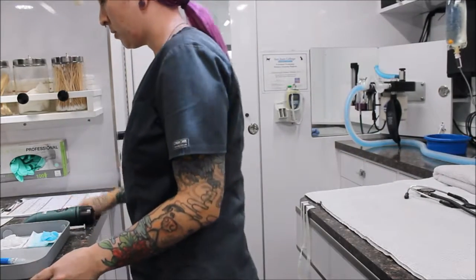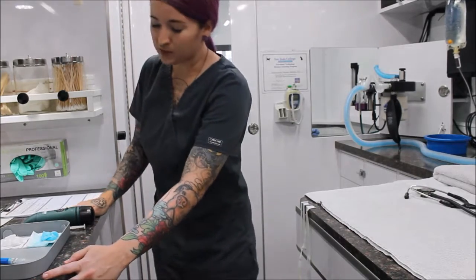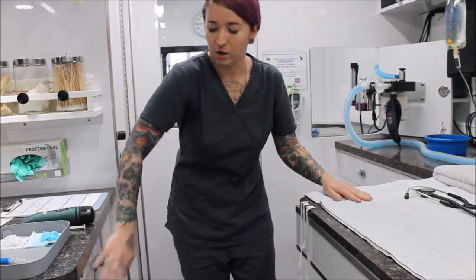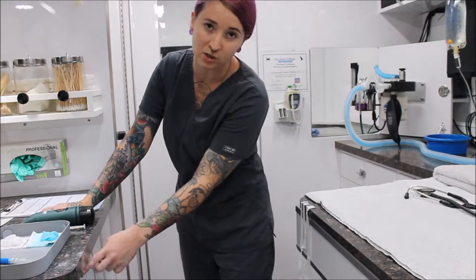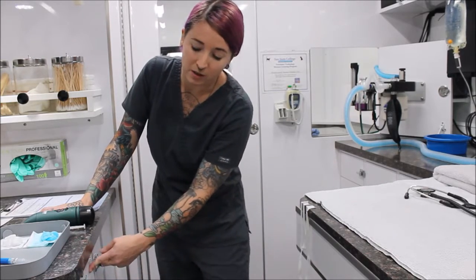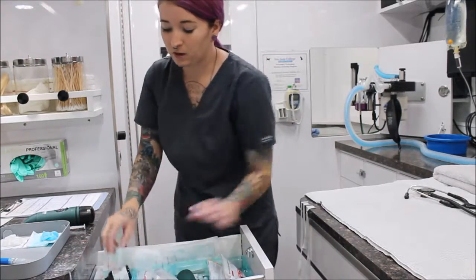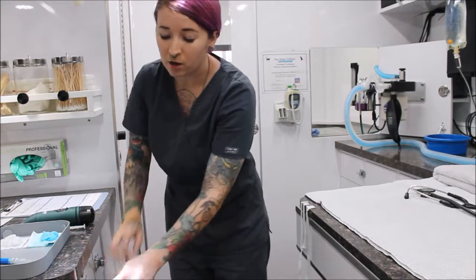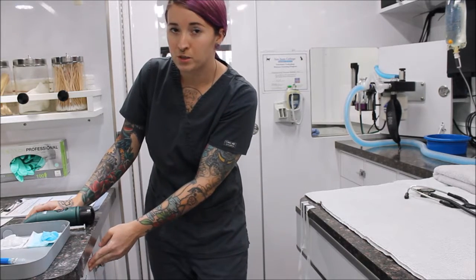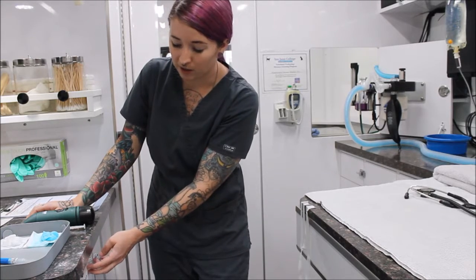So the next thing I'm going to get prepared, or make sure that I know where it is, is my emergency drugs. So we keep our emergency drugs right here in this drawer, which also has a lock on it just in case we're not around. But it is labeled emergency drugs on the front of the cabinet. So I know where those are, and everybody else that works in the clinic knows where they are as well. But before the procedure, I will go ahead and just verify that they do know where these drugs are kept.